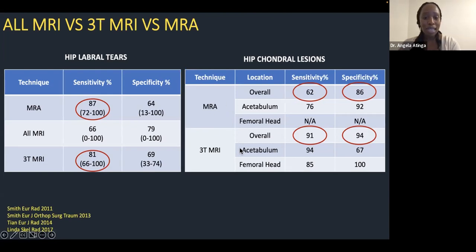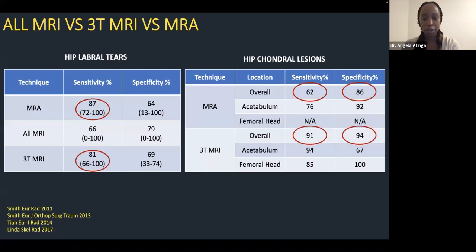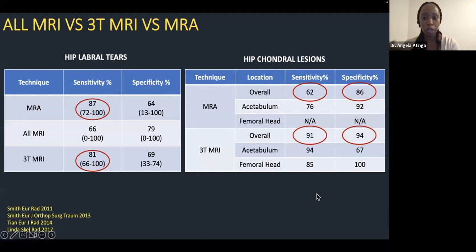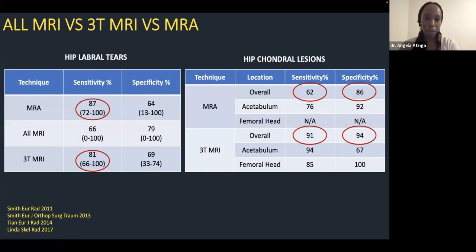If the patient has had any form of surgery — a scope, labral repair, or treatment of a CAM lesion with bone removal — our routine practice is to go straight to MR arthrogram, because the problem-solving capacity is better in those post-operative cases.